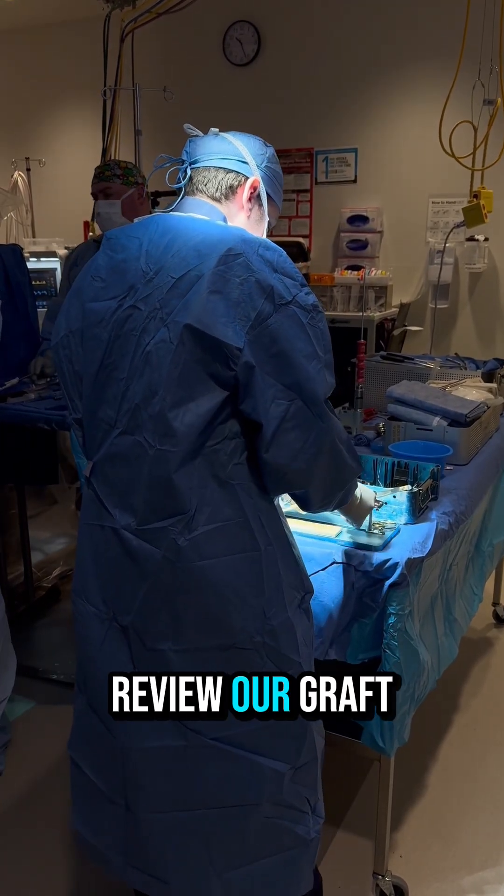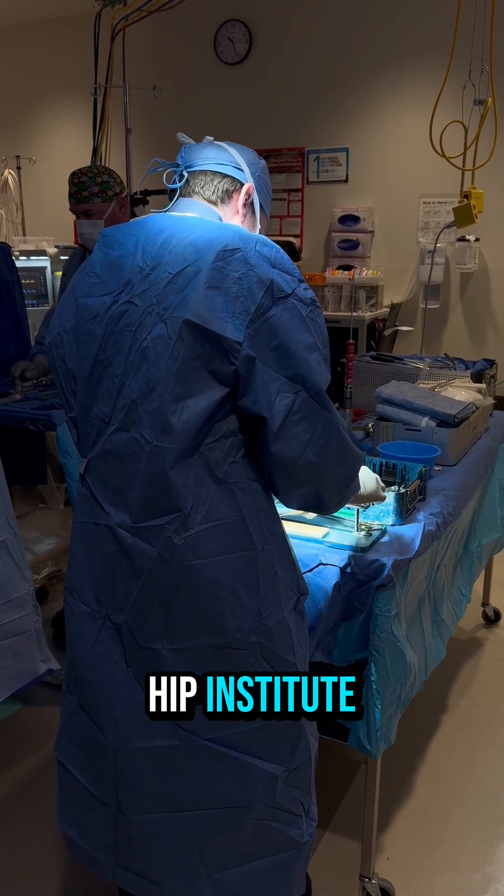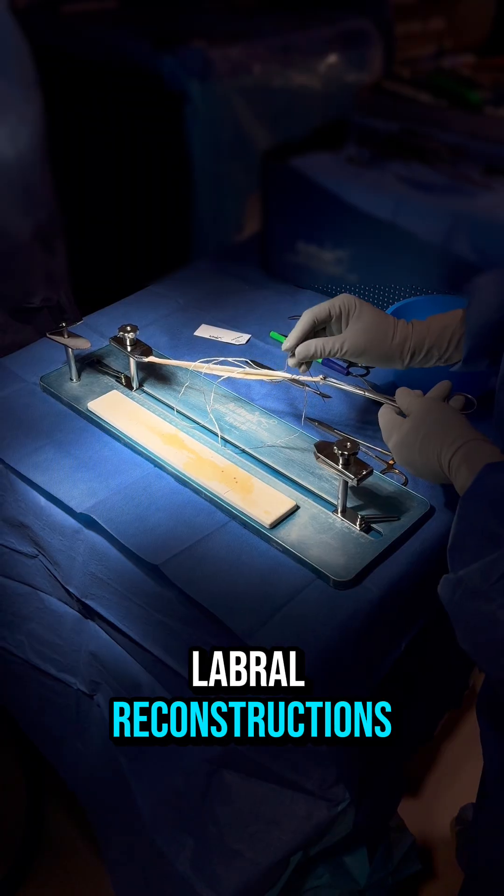Hi everyone, today we will review our graft preparation technique that we use here at American Hip Institute for our hip labral reconstructions.